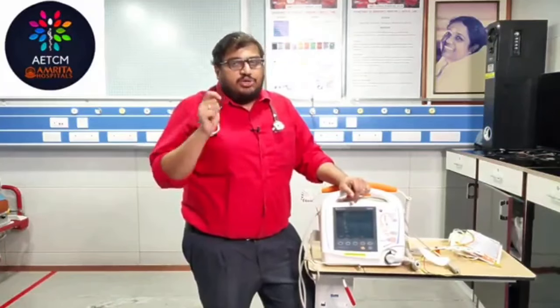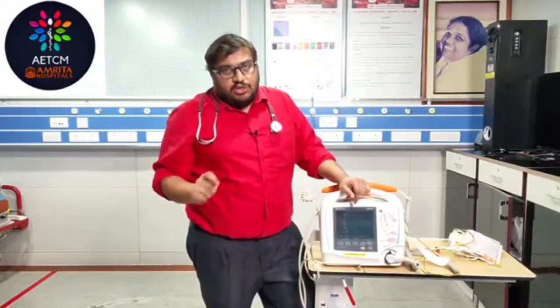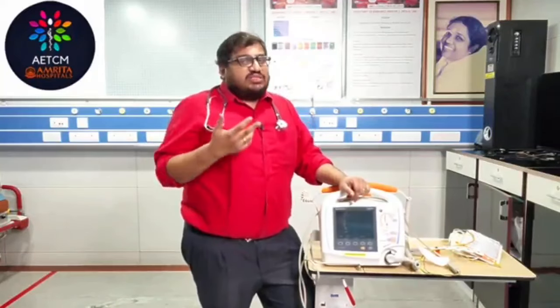The next thing is that you need to shout once or twice, and also make sure that your oxygen source is cut off. Nobody is touching the patient and the oxygen source is cut off, because there is a chance of ignition also. So you need to make sure that these things are not happening, and you defibrillate.